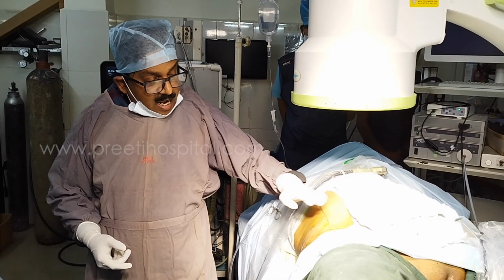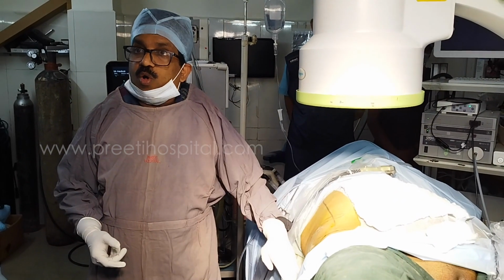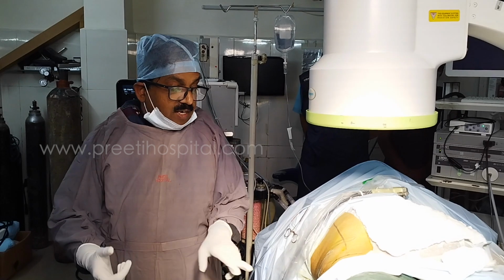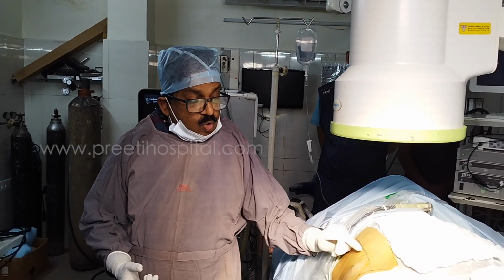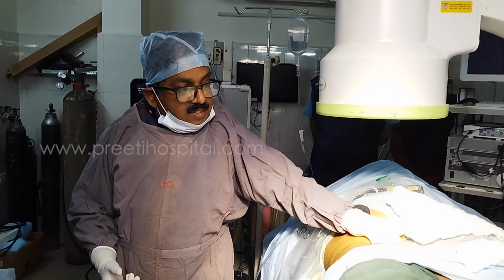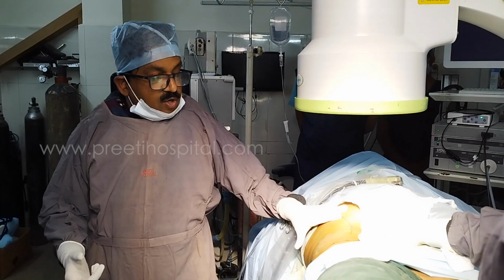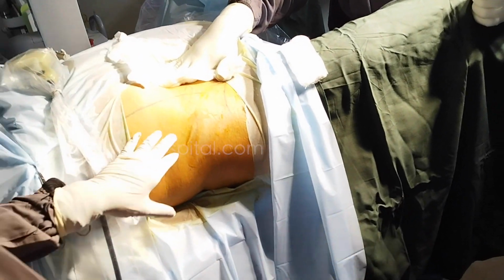So if the anterior-posterior depth is more, you have to go vertically down, then the length of the needle matters. Whereas in supine PCNL, it is horizontal. The kidney to skin distance at the horizontal level we have to see. For that, sometimes you strap like this. People will hold like this, so that skin will be stretched and you will have a straight tract. See, automatically.